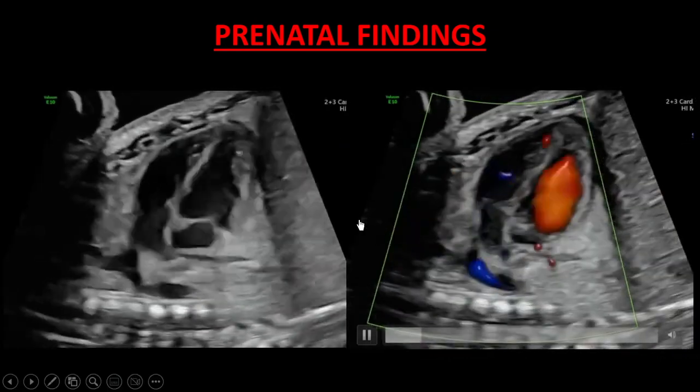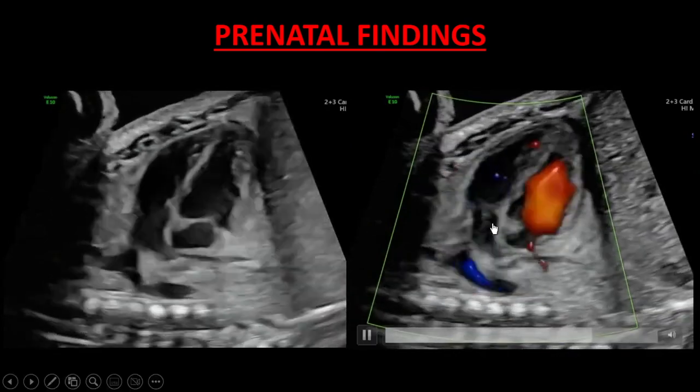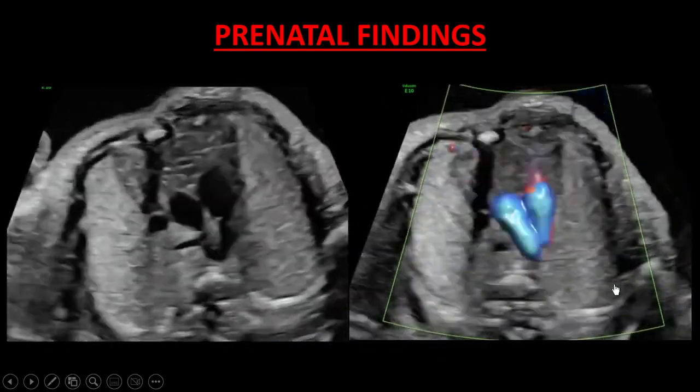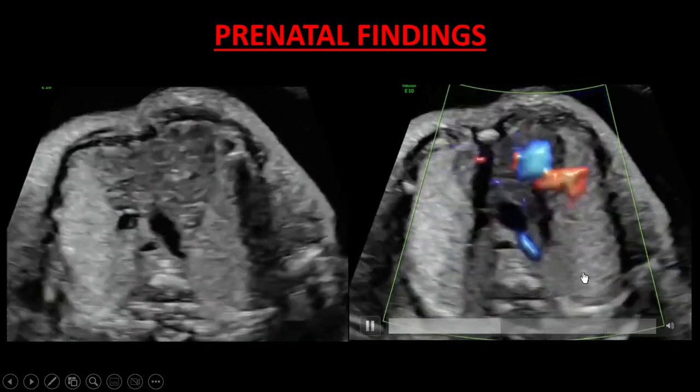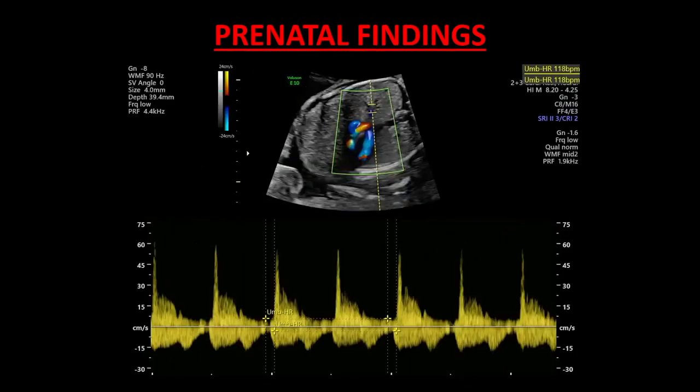We obtained all the views which are necessary to complete the fetal echocardiogram. You can see that the outflow tracts show no problems. The 3 vessel and trachea view, again, in 2D and in color look perfectly normal. And then we measured the heart rate at the beginning of the exam. It was 114. Then we measured that at the end of the exam.